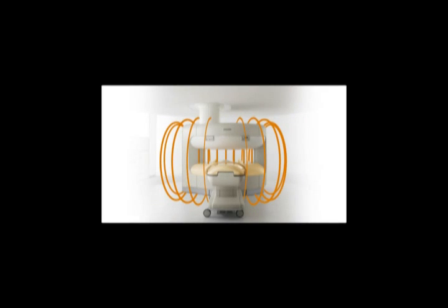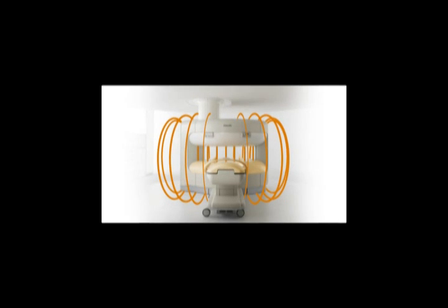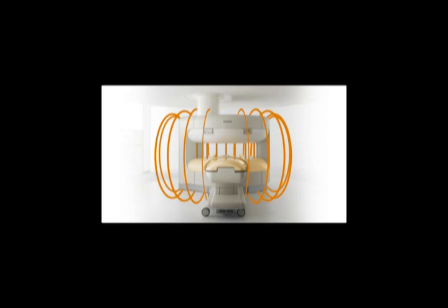In a cylindrical system, the field lines are horizontal, but in an open system they are vertical. This means that the magnetic field around the magnet is different, creating different effects within the field.